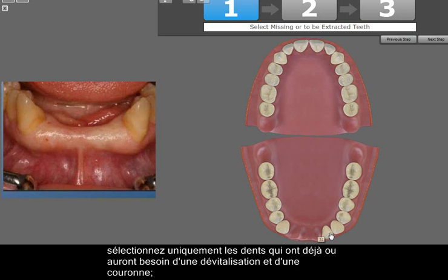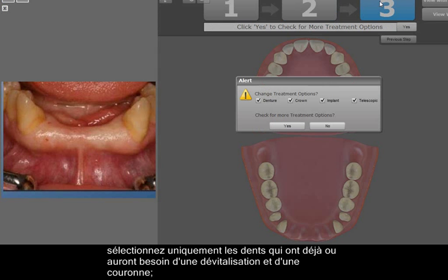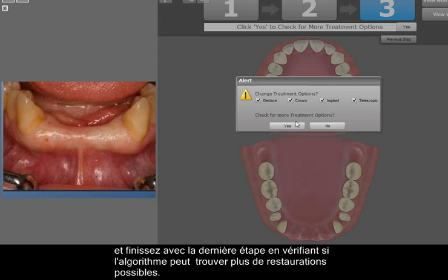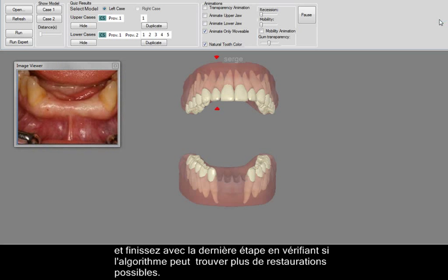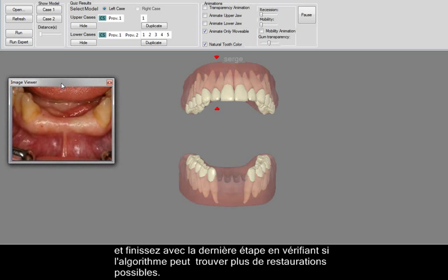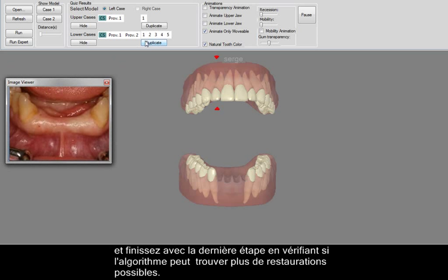In the next step, select teeth that already have or will need a root canal and crown, and complete with the final step by checking our algorithm to see if it is possible to find more possible restorations.